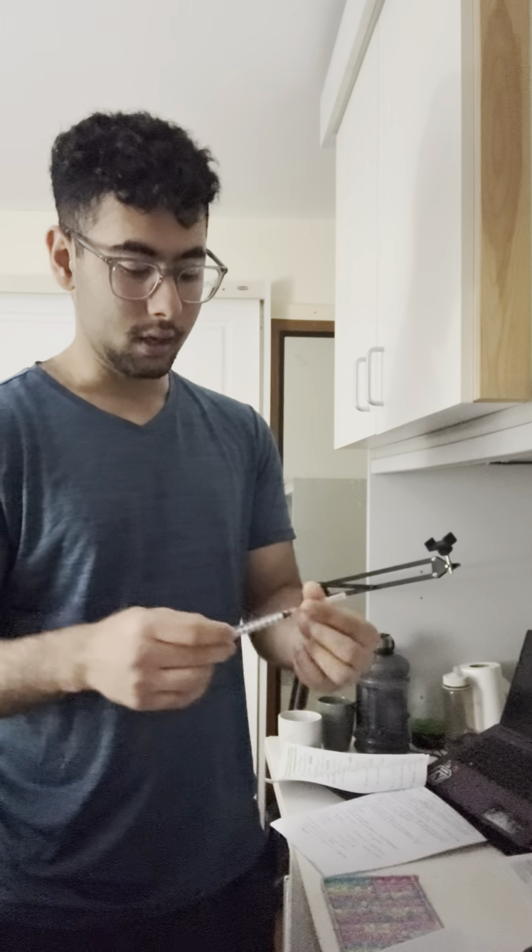I already put it there, take it out, and it goes directly in the yellow sharps container. But I'm going to reuse this for now because I don't have one. But don't do it in real life. Just chuck it in the sharps container.